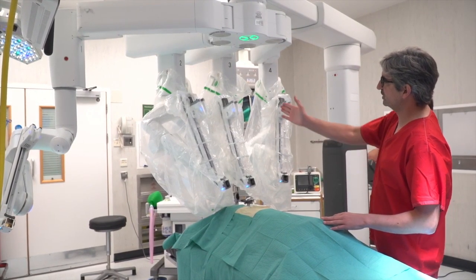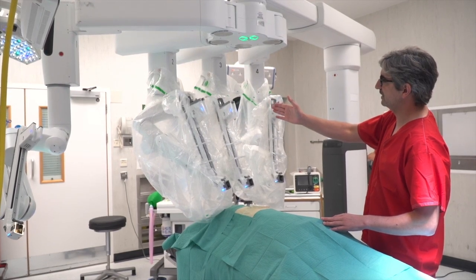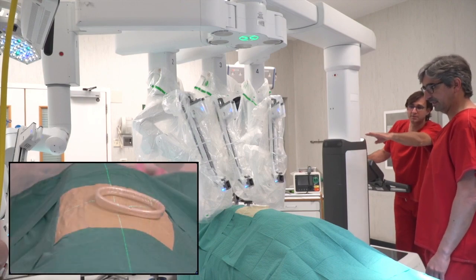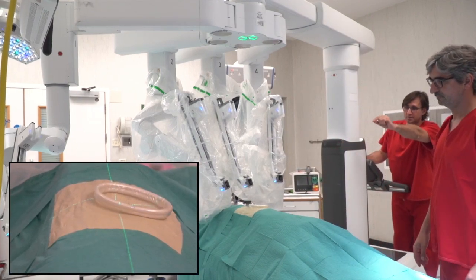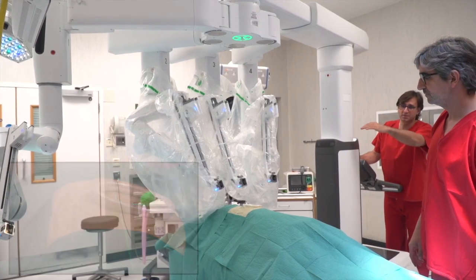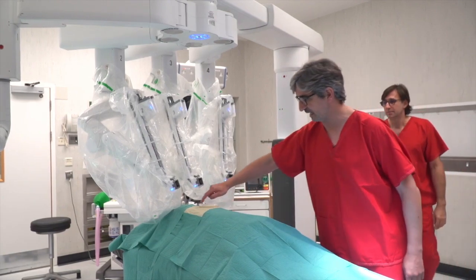We can rotate a little bit more the boom because the line must be parallel with the patient. A little bit more rotation here. You see the line — the long line must be parallel with the table. Yes, this one. The cross at the upper part of the incision and the line parallel with the patient. More or less parallel, this line.